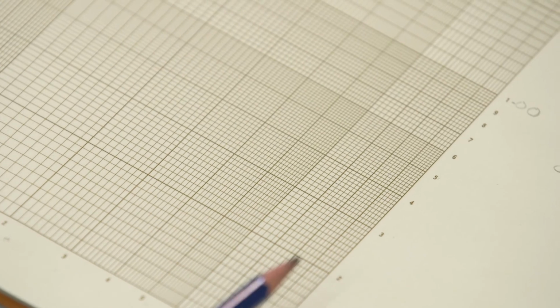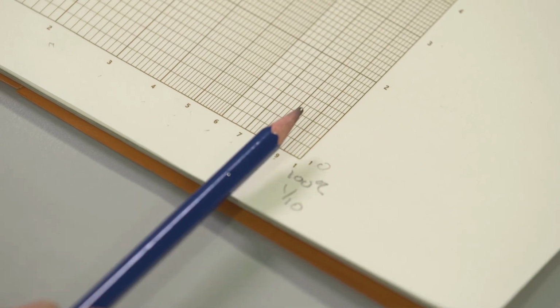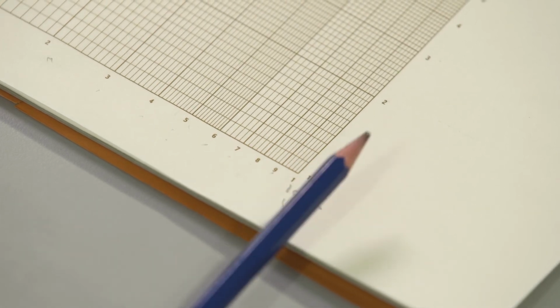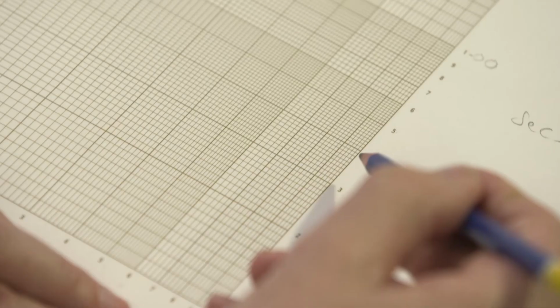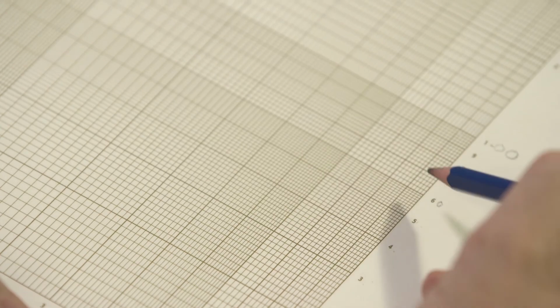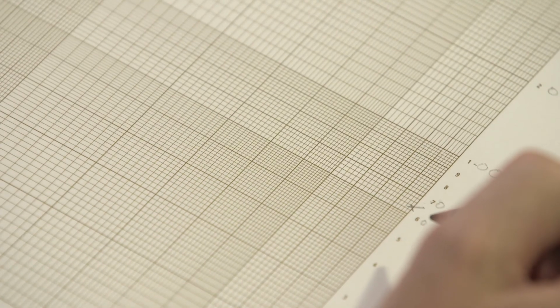Which was the clotting time for the standard 1 in 10 dilution? 63 seconds, 64 seconds. Very close, so we should take an average, 63.5 seconds. So we need to locate on the vertical axis, where is 63.5 seconds? 10 seconds, 20, 30, 40, 50, 60, 70. It sits here between 60 and 70, very close to the 64 point on this axis.